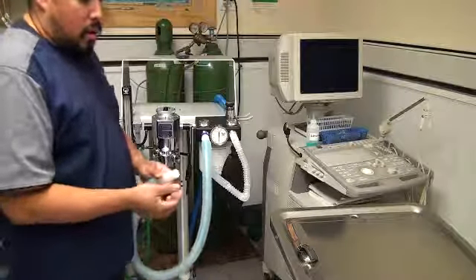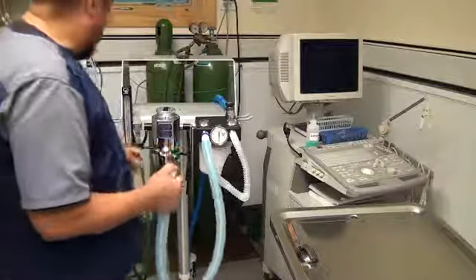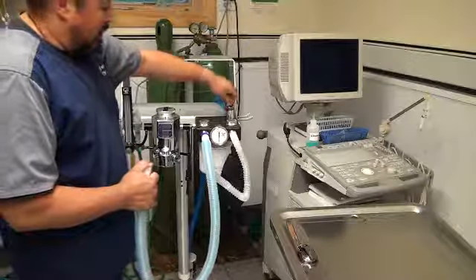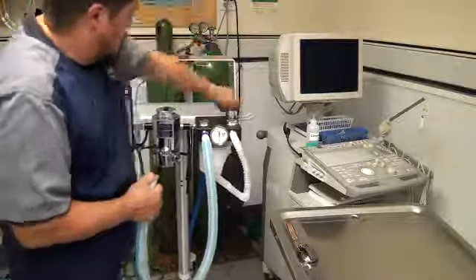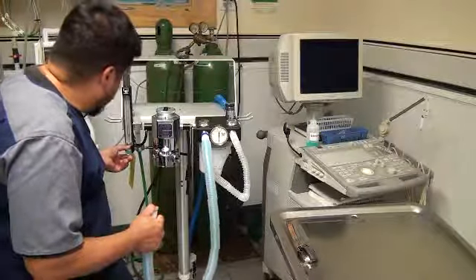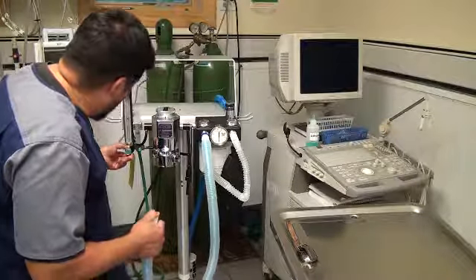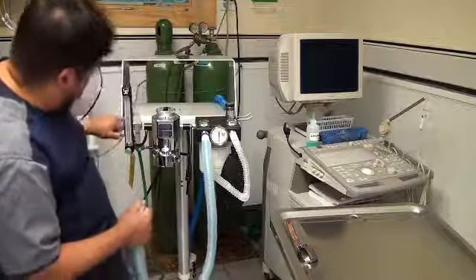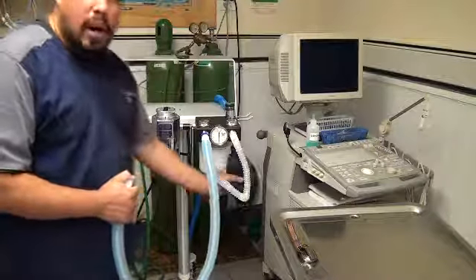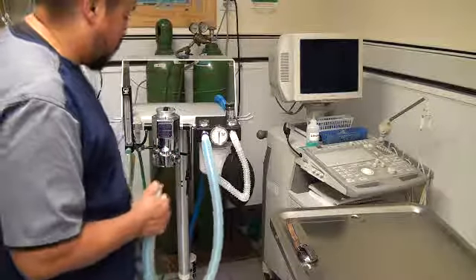Once we start, I'm going to occlude the tubing with my thumb. We are going to close the pop-off valve. That's shut off. And we're going to raise the oxygen in the flow meter to 2 liters per minute. This model is read by reading the middle of the ball bearing on the indicator line. We are starting to see our reservoir bag inflate a bit.